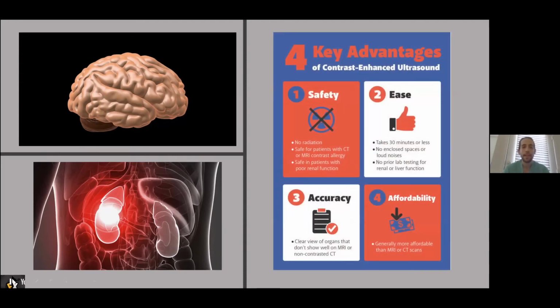So it can have some cost savings, so avoid money. It also avoids some of the issues with brain deposition of MRI contrast, nephrogenic systemic fibrosis, and contrast-induced nephropathy, if you still believe in that. That's a whole other lecture to go into. It can also aid in patients who have true allergies to contrast dye, and not those iodine allergies that we hear about a lot.